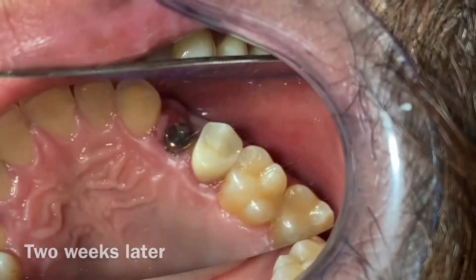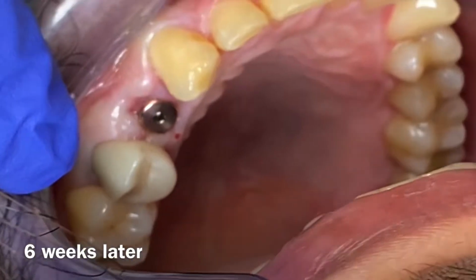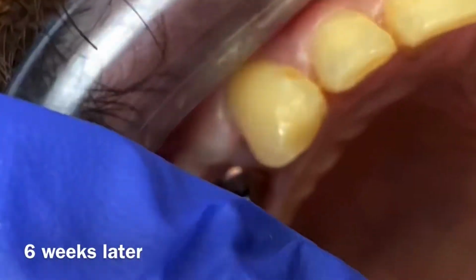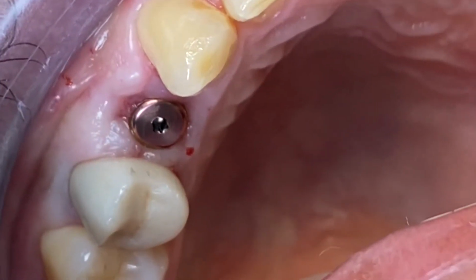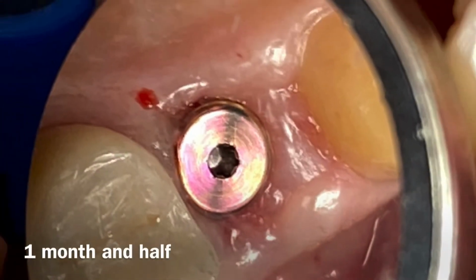And now this is just a month later, and you can see that the gum healed pretty nice on the buccal surface and the lingual surface. So I was happy to see the result. I went ahead and retightened the healing abutment deeper, because some of the particulate bone didn't allow the healing abutment to go all the way in. So today I numbed the patient a little bit and tightened it up. This is how it looks. You see the result in a month and a half.